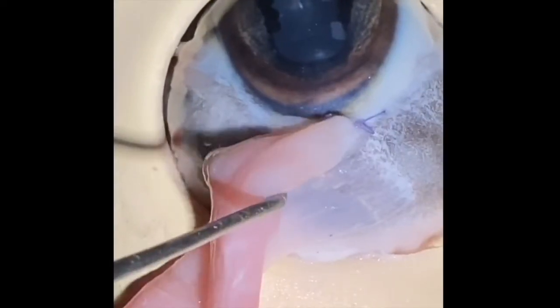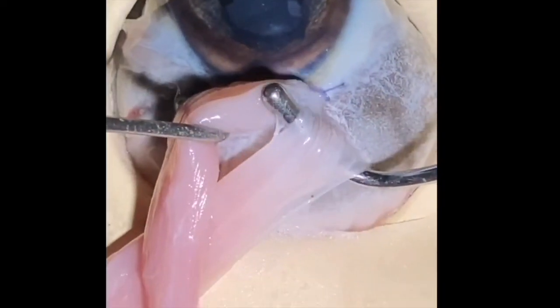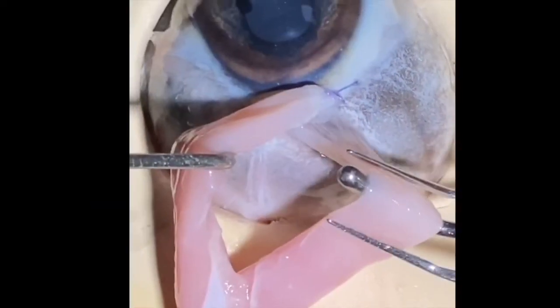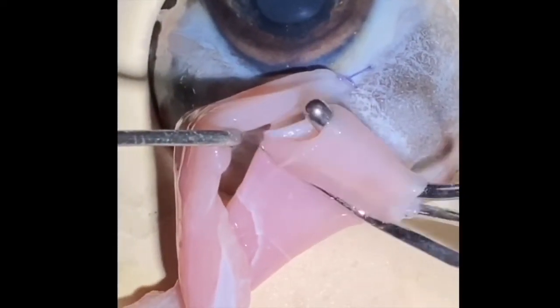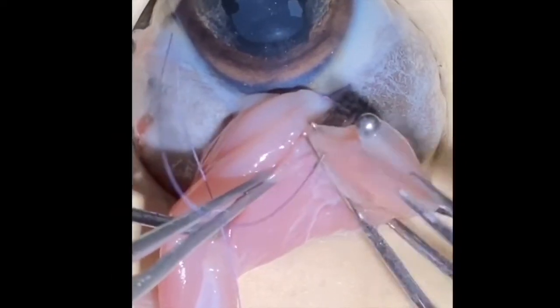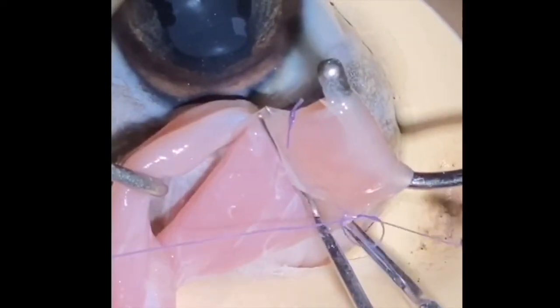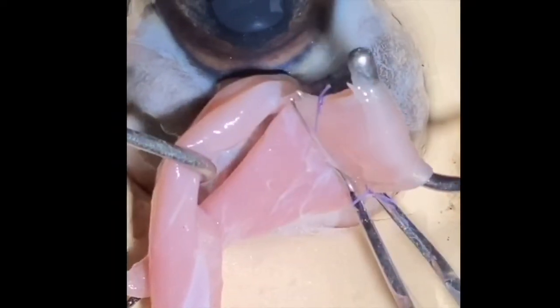To simulate the superior oblique muscle surgeries, superior rectus is hooked and retracted to expose the underlying superior oblique. The superior oblique is then hooked and folded upon itself. Sutures are then passed at suitable length to perform the superior oblique tucking procedure. 6-0 vicryl sutures are passed at both the ends and superior oblique tucking is completed.